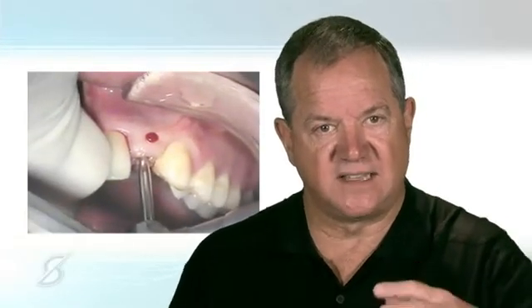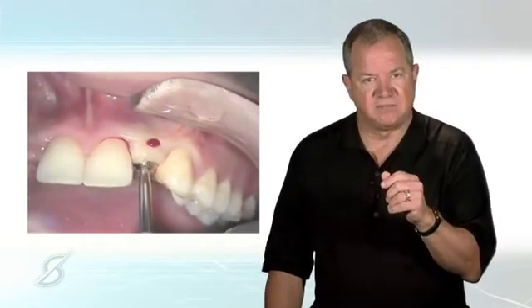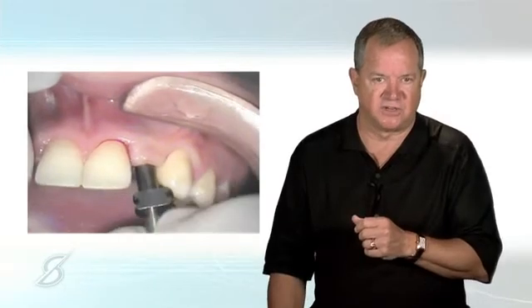And just to show you the actual process of what it's like to get impressions, this isn't the same patient, but I want you to see how difficult it is sometimes to actually get down to the head of the implants on these cases where a lot of soft tissue grafting's been done. So you'll notice that I've injected the papilla till they blanch, and now I'm taking the healing abutments off. I like to inject directly into the papilla and all the way through to the palate, because in my experience the patient's more comfortable than if I just give them an infiltration.